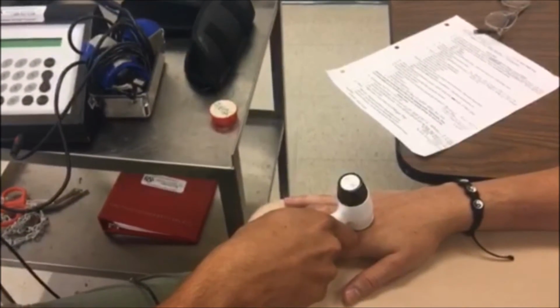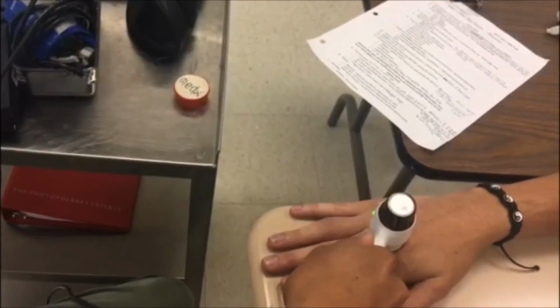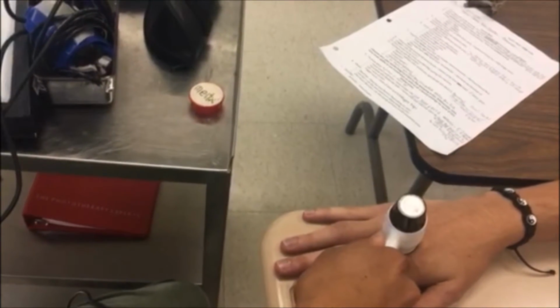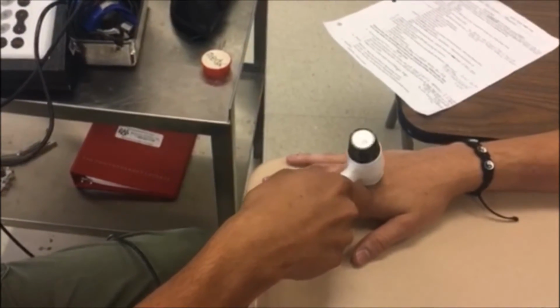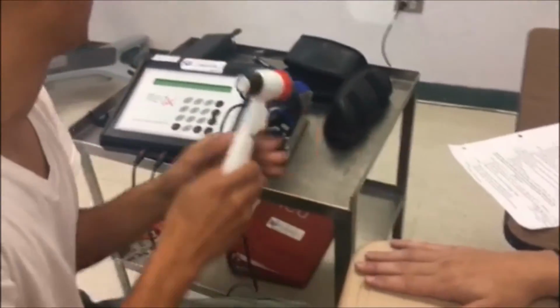Okay, it's counting down. Now I should mention the time is automated depending on how many joules you use. So that's good. Alright, so you could continue moving along to each joint as long as you don't repeat the area of treatment.